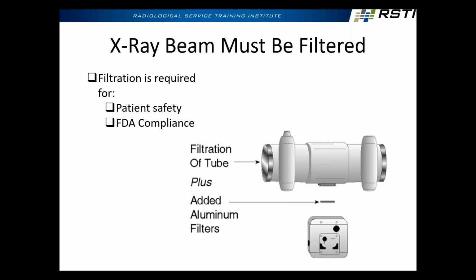So in things like cardiac catheterization procedures, if they want to look at the blood vessels of the heart, what don't they want to see? They don't want to see the rib cage. They don't want to see the sternum, right? They're shooting from the back. They don't want to see the thoracic spine. They want that all to go away, right? So they use copper as the filter to make the bone transparent. Well, if copper at 29 is making bone at 13.8 transparent, what's it doing to the heart at 7.42?